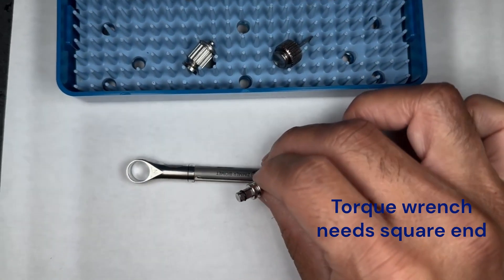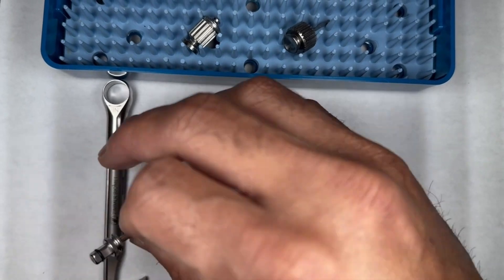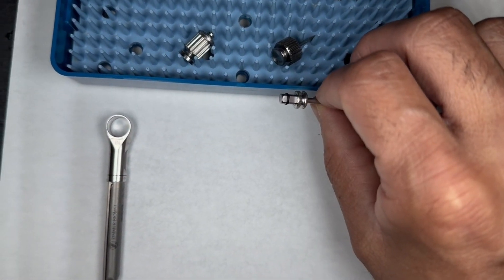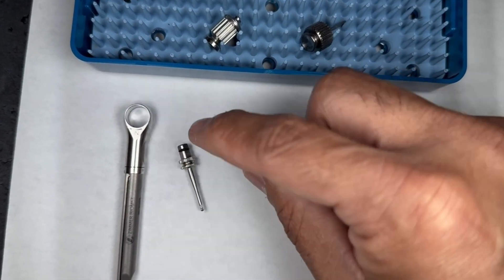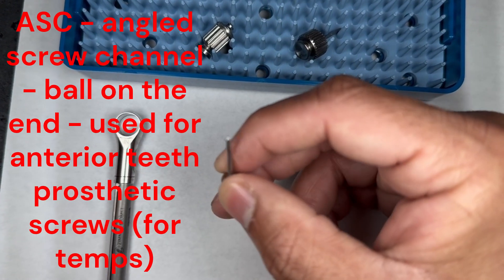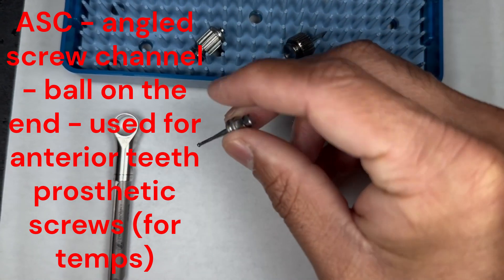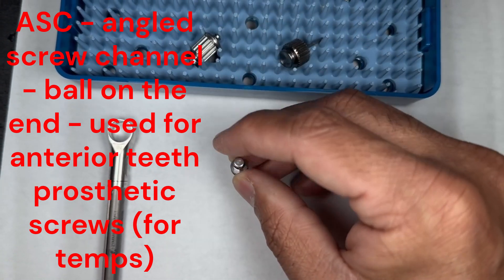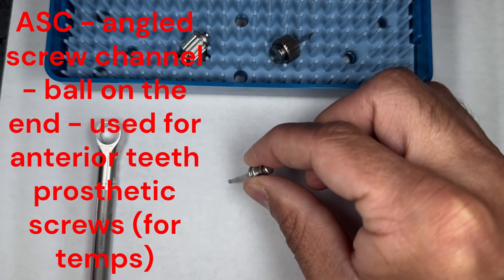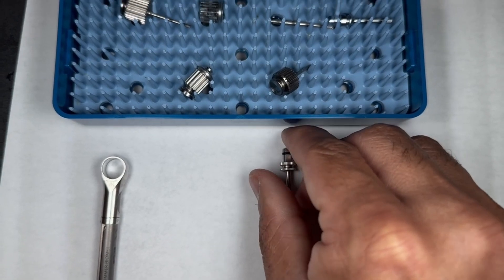This is going to be torque wrench piece number one. This is one of the things that will go in the torque wrench. This is an angled screw channel — normally when you're putting a screw in you want to go straight down, but this one can also be turned at an angle and still drive that screw in.